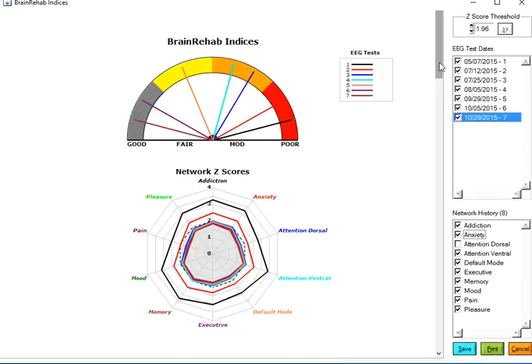You can also review it at no cost. This is a per use product, so that you're charged every time you do a test.